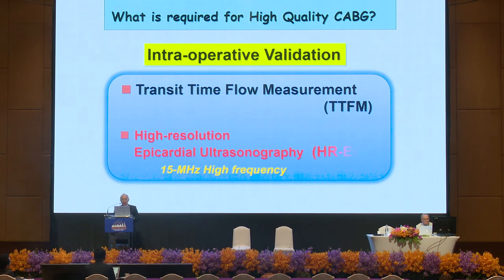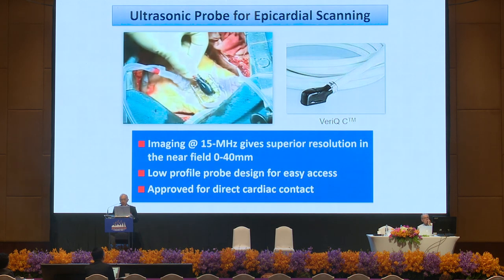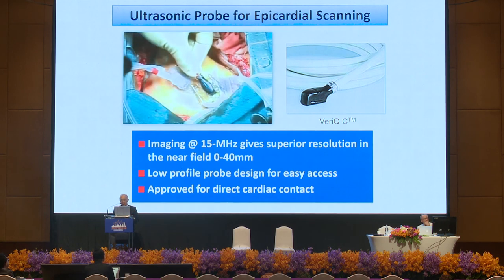Definitely something is wrong. So then we have to check by using a high resolution epicardial ultrasonography. It is a very effective tool. So how do I apply this? First, the probe is very, very small. You can put it anywhere on the heart, on any surface of the heart, easily.